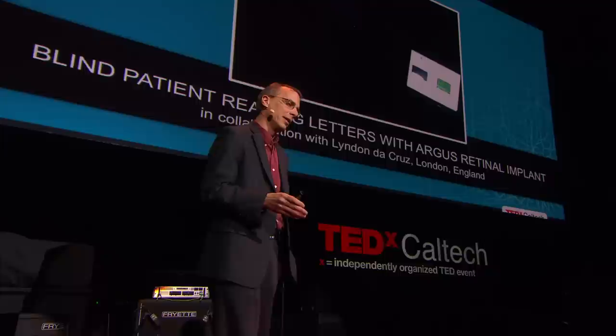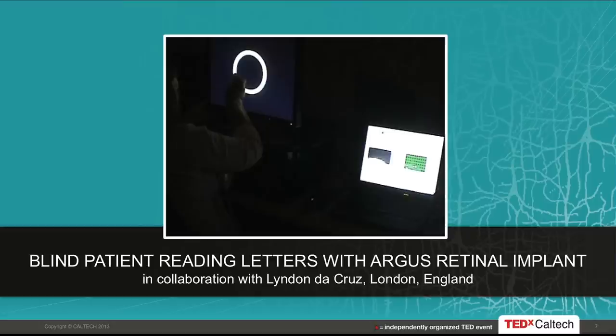Here's an example of what patients can do with the device in a clinical setting. The patient is looking at a screen showing the letter O, and there will be progressively smaller letters, and she'll tell us what she sees using the camera. On the lower right is a laptop with two video windows: the left window shows the camera view, and when letters are large the patient has to move her head to see the entire letter. The right video window, green with black dots, shows the stimulation pattern being applied to her retina by the intraocular electrode array.